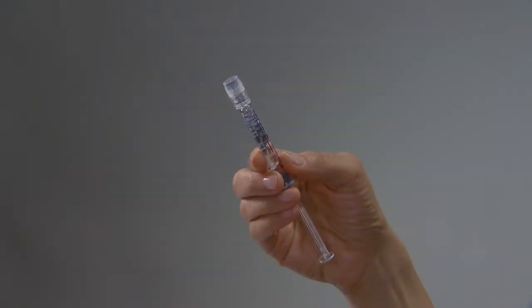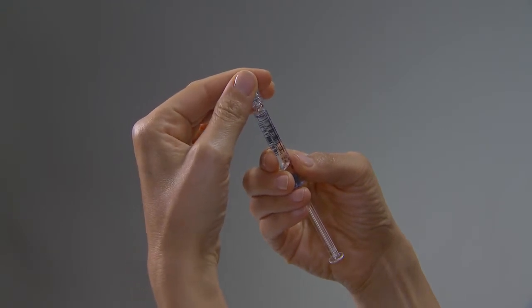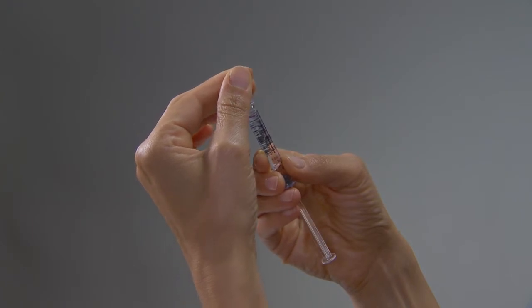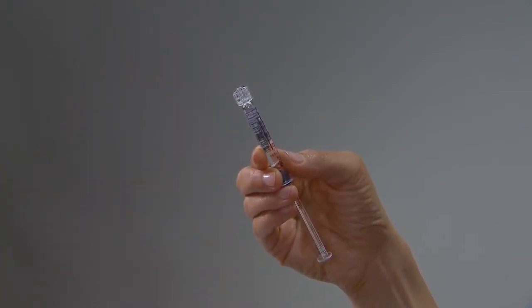Hold the barrel of the pre-filled syringe of sterile water in one hand. Firmly hold the plastic cap between the thumb and forefinger. Gently snap and pull off the white cap. If the gray cap inside remains, simply remove it.